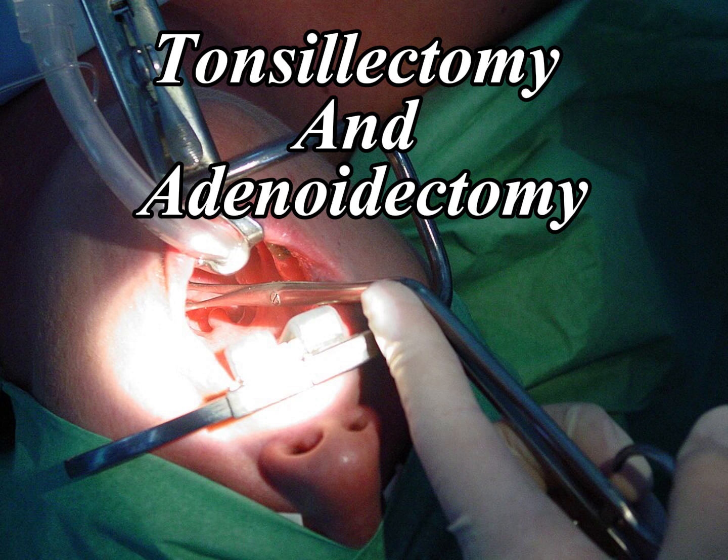Today, we're walking through a combined tonsillectomy and adenoidectomy, or TNA, a common ENT procedure performed for recurrent infections or obstructive sleep apnea, particularly in children. Let's scrub in. Step 1.